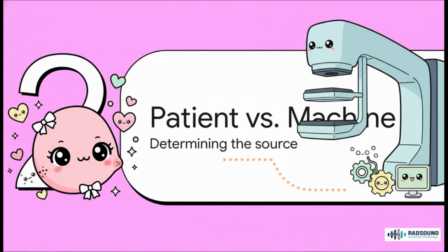So step one in any investigation is asking the big question: did this come from the patient or from the machine? We're going to start by looking at artifacts that actually come from the patient, because these can be some of the most common and, frankly, the most convincing imposters out there.